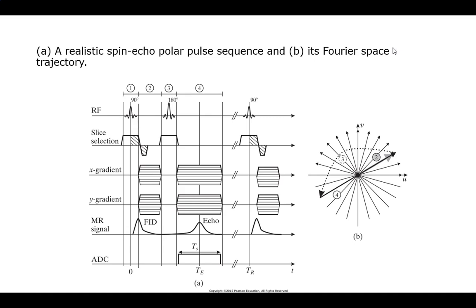The one key thing that looks a little wonky is when you're doing echoes. When you're not doing echoes, it's pretty straightforward. You move the opposite direction and then read out. When you're doing an echo, you have to move to the end, echo, and then read out. That really is the whole thing this graph is trying to emphasize.